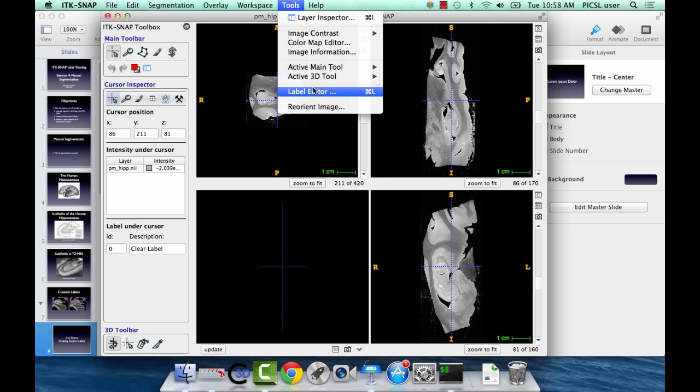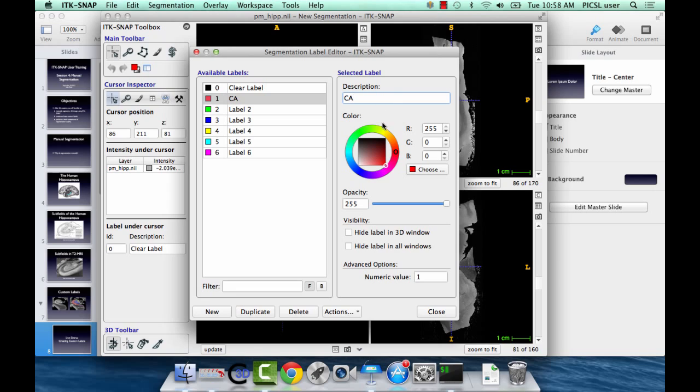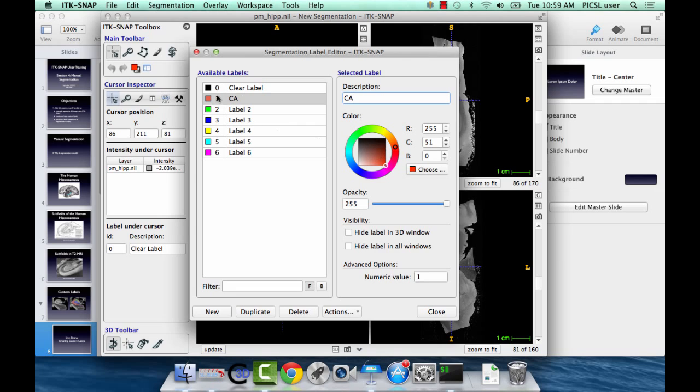So, under tools in Snap, if you go to the label editor, we get this menu. So, the available labels section here, this is all the labels that we use in the image. You can change the name of the label. So, we can change this to CA, for instance. And this section right here is the integer value that's assigned to that label. That's what you use when you're doing inference. You can ask the program for the volume under label 1, for instance. And then the color. The color is just how you keep track of it. You might want to have distinct colors for distinct regions or different shades if you want to group them somehow. You can change the color either with manual input here or just by clicking around on the slider here.